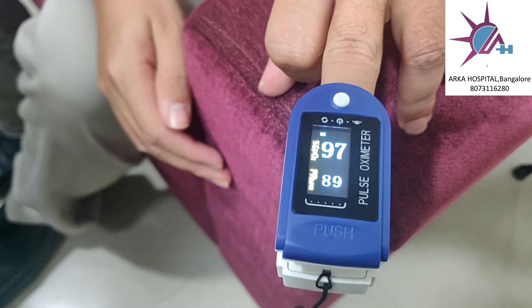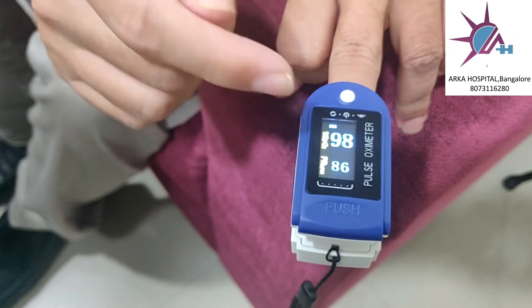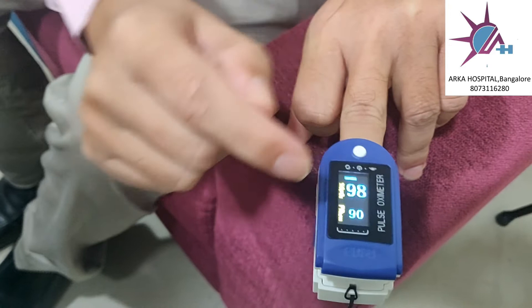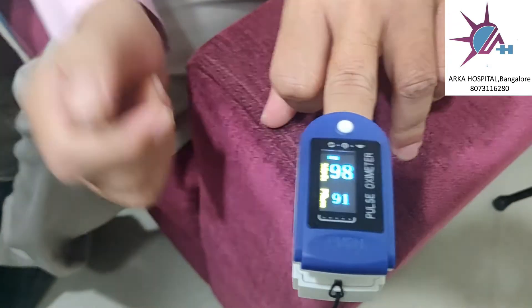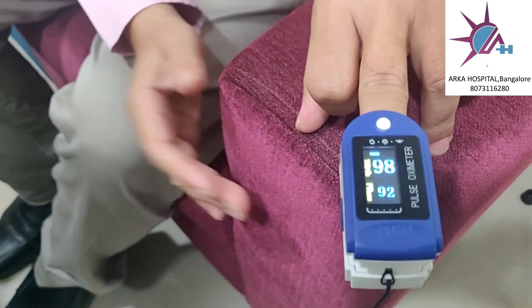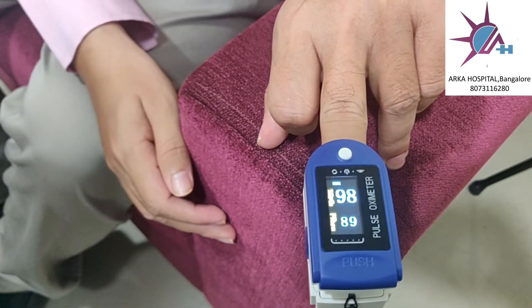The first reading is SpO2 — the oxygen level in your blood. In my case it is showing 98 percent. The second reading is pulse rate, meaning heartbeat rate per minute. These two readings you can take.